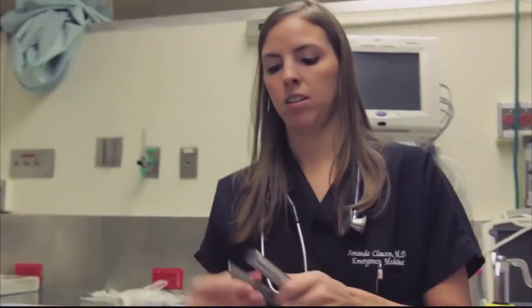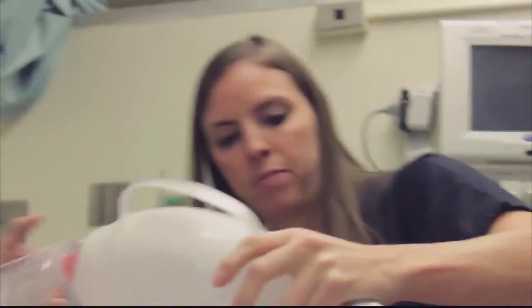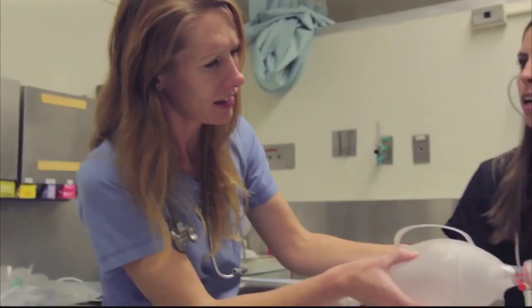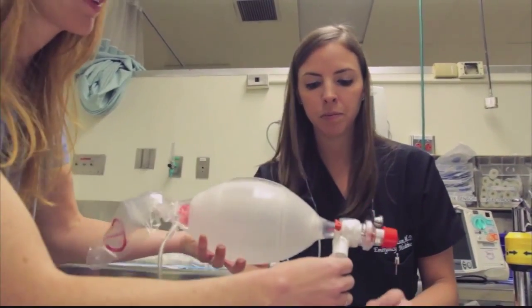All right, we have RT here, we've given the drugs, let's go ahead and intubate. Everybody ready? Okay. All right, I can visualize the cords. I don't see any foreign body. Nurse, can you hand me my ET tube? Okay, let's try to bag them. I'll secure the tube in place. Hey guys, what's going on? I can't bag. Usually the appropriate depth of the ET tube is 3 times the uncuffed ET tube size. But in this case, I think we should try to push the foreign body deeper in. So go ahead and push it to the right main stem and then pull back and see how we do. Okay. Going in. All right, now I'm pulling it back out. Let's hook it back up again.